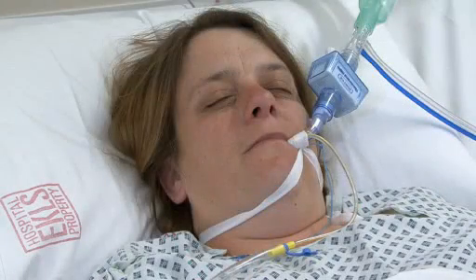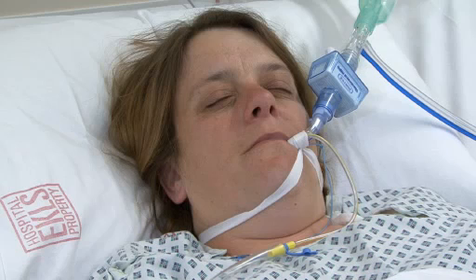Patients receiving long-term ventilation should be adequately humidified. Please refer to the instructions for use for further details.